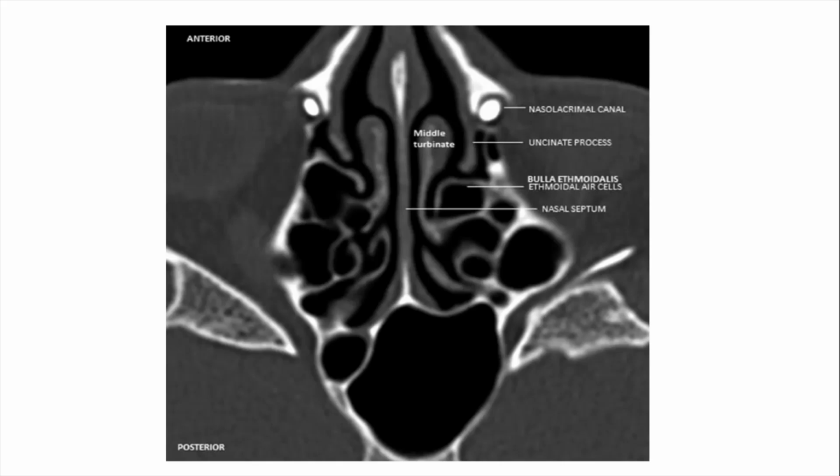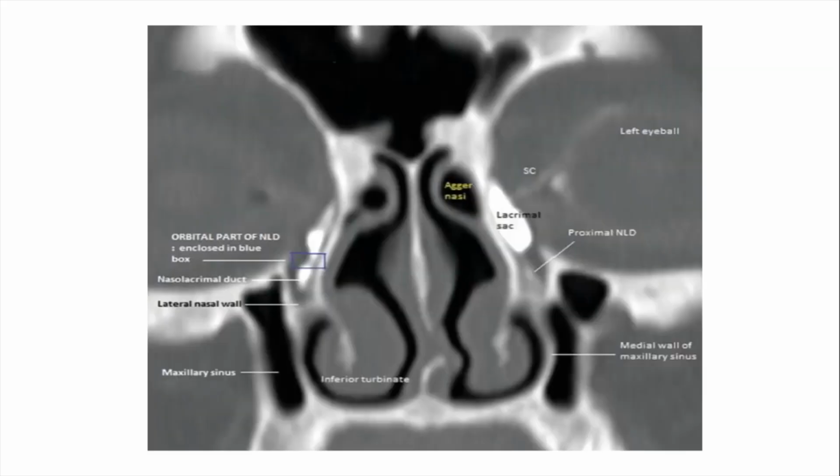So the radiology is very important. The radiological assessment of the turbinates and anatomical block at the level of the lacrimal sac, like gross septal deviation. Gross septal deviation can completely compromise your endoscopic view of the lacrimal sac apparatus. Especially your turbinates and this area. This area is very important to go for access. That's why assessing the septum in the midline is the gold standard for any endoscopic surgeon dealing with endo DCR, as well as nasal polyps and any other anatomical obstructions at the level of the lacrimal sac, which make it very difficult to give exposure for the sac.